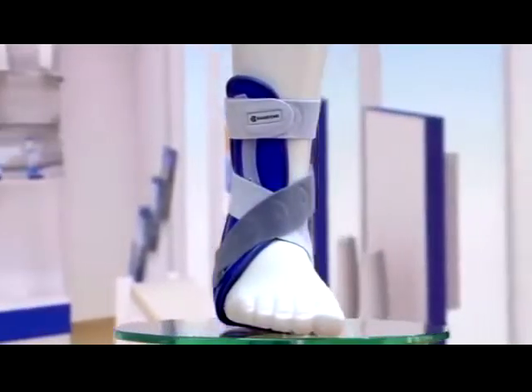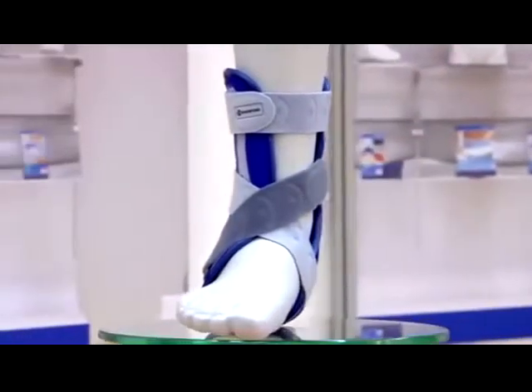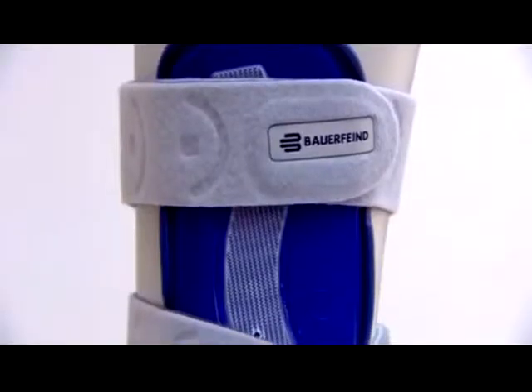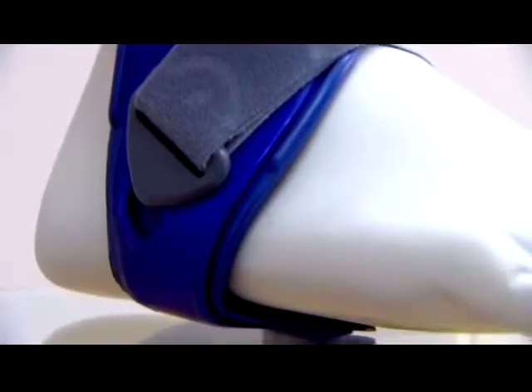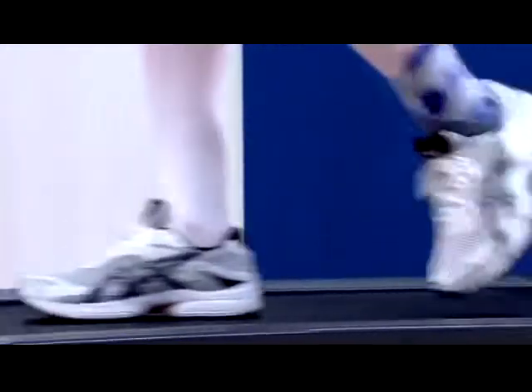Malleolock from Bauerfeind is an anatomically contoured stabilizing orthosis for stabilizing the upper ankle joint. It reliably prevents the ankle from bending outward to the side, supports the muscles, and permits a natural sequence of movement. Malleolock offers optimal security in the acute care of injuries to the upper ankle joint and ligaments, as well as after surgery.